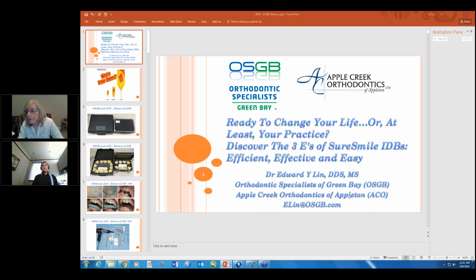Okay. How do you limit flash or clean flash doing this SureSmile IDB? Well, we always tell our assistants more is better than not enough because you don't want to have voids. I showed you the slides of them using the Opal Seal cotton applicator tip with a little bit of Opal Seal, packing that in there. The liquid is a little viscous, but it gets the Transbond to flow a little bit, and you want to make certain you have enough. So you've got to make certain the Transbond is enough, but not too much.